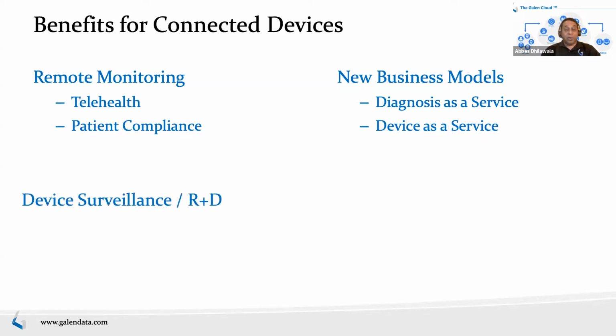Another thing is just pure device surveillance and R&D functions. When you deploy devices in the field, you have issues. You need to understand your device health. Having connected devices allows you to do monitoring essentially nonstop and make sure you can catch things before they become an issue. Diagnosis: if you do find something, instead of having to ship that device back and read its logs and then figure it out, or worse, for some large equipment, having to send people down to certain places to do the diagnosis, if you have connectivity, remote device diagnosis becomes an option.